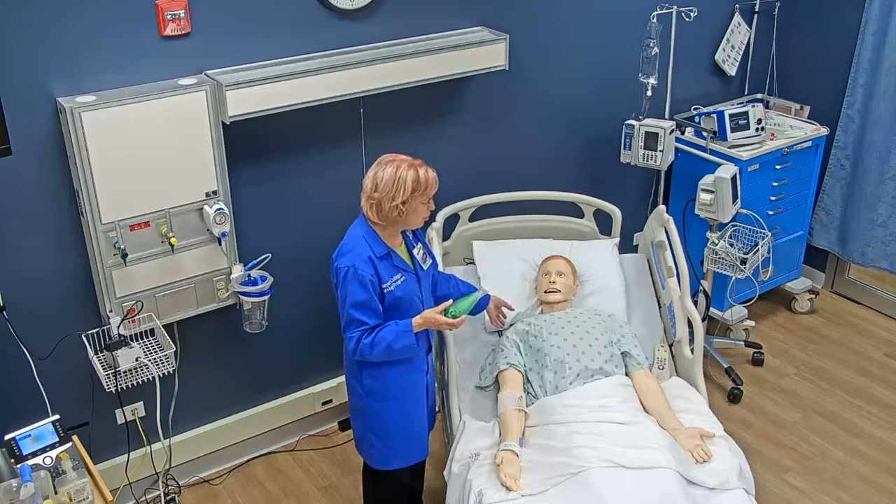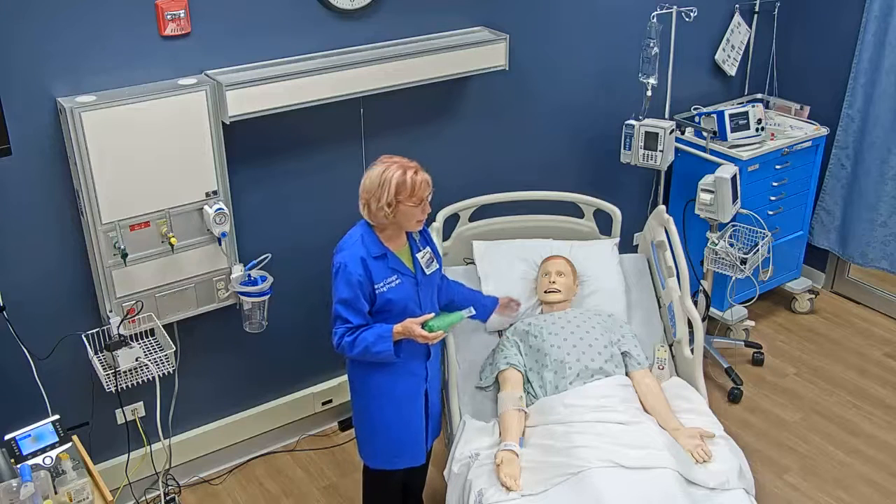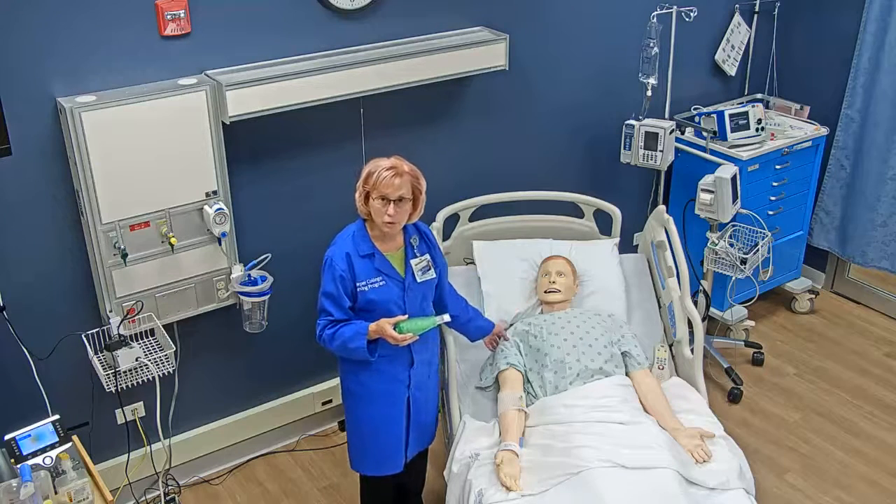Then I'm going to have my patient sit up. If the patient can get up in the chair, that is best. If they cannot, a high Fowler's or Fowler's position is okay.